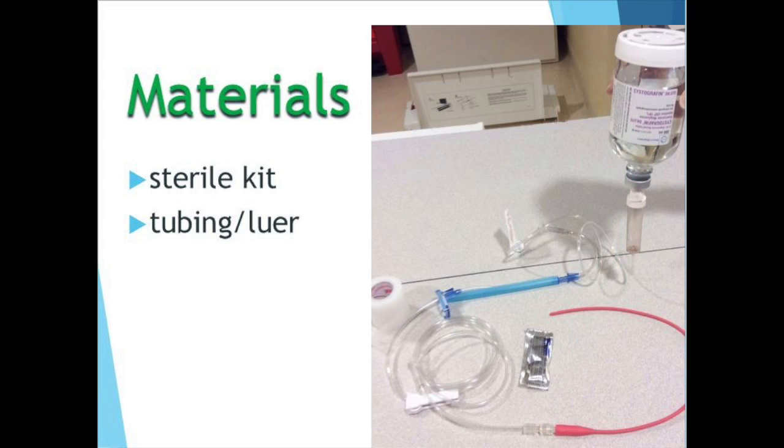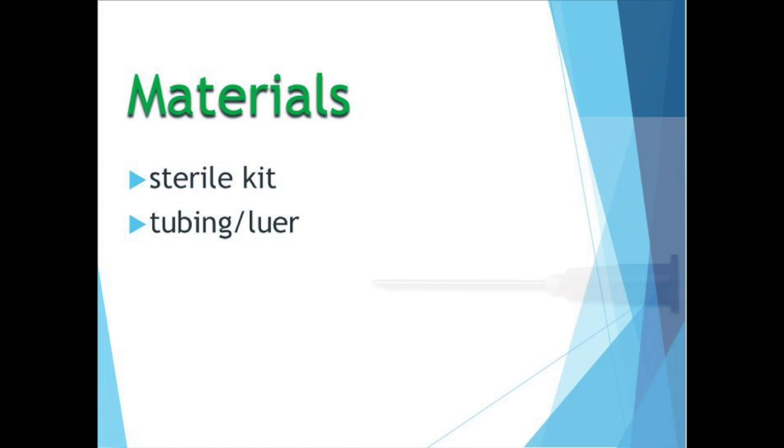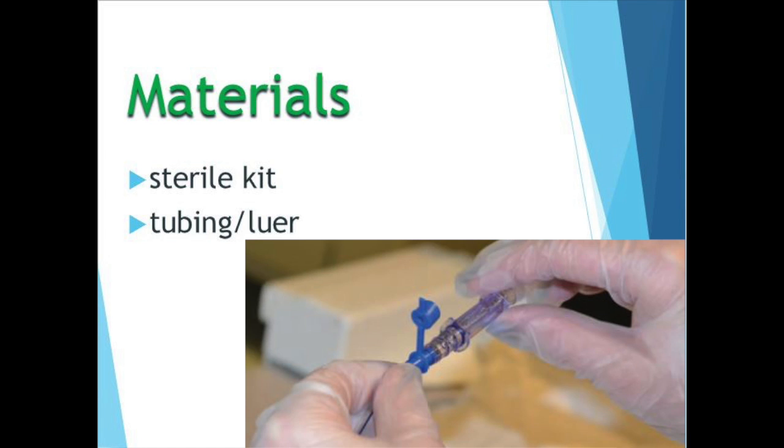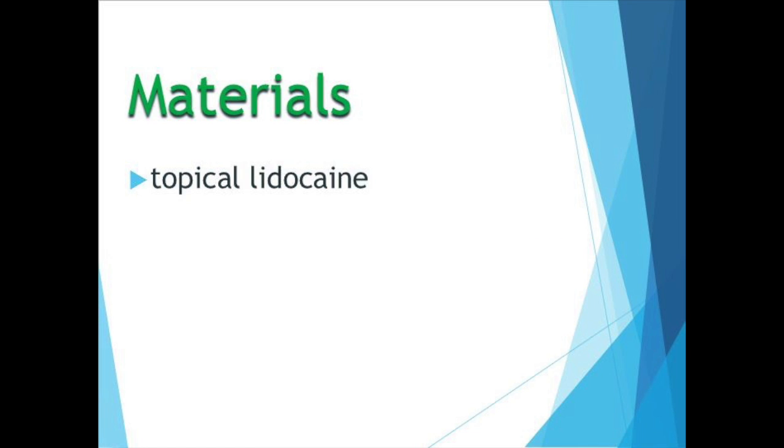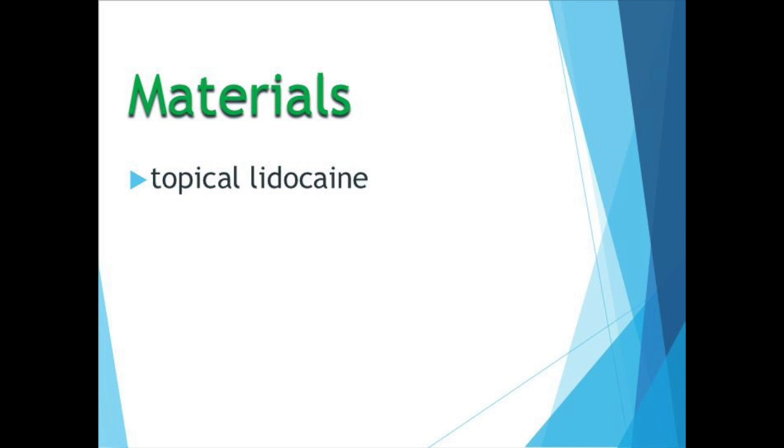You'll also need plastic tubing with a flow control device, an 18-gauge needle to allow contrast flow, and a luer to catheter adapter to connect the contrast to the catheter. In males, to diminish sensation or pain, a topical anesthetic of 2% viscous lidocaine gel may be instilled retrograde into the urethra with aseptic technique. Anesthetic gel may be applied externally in both males and females.